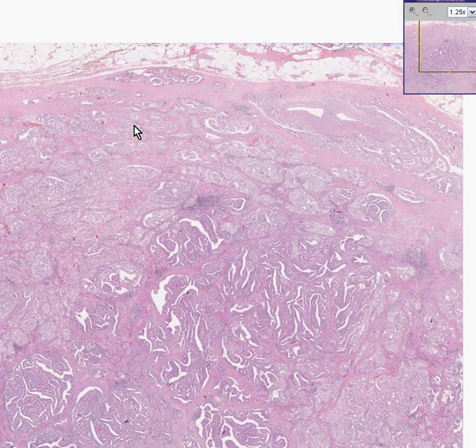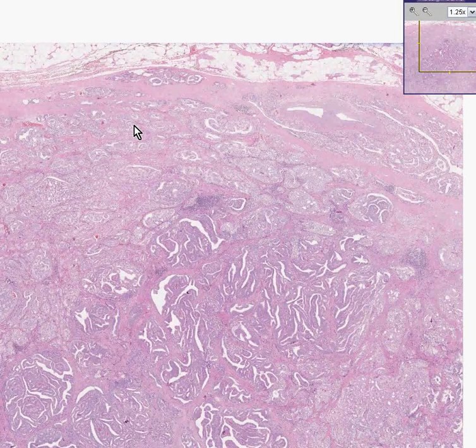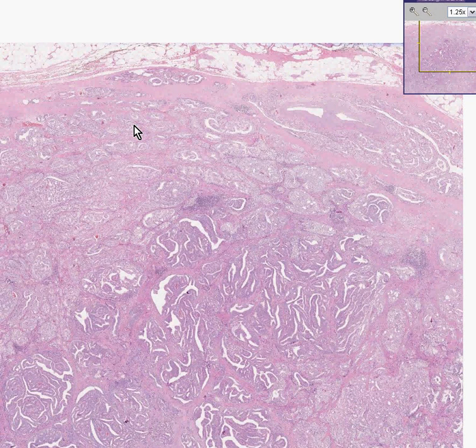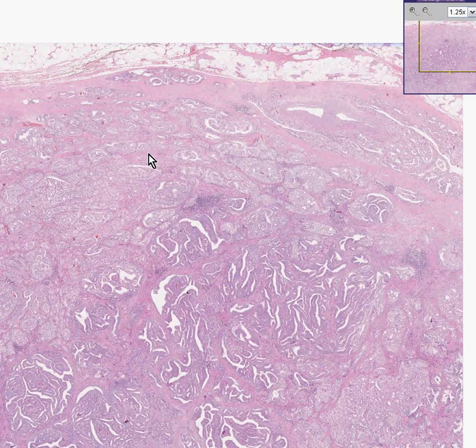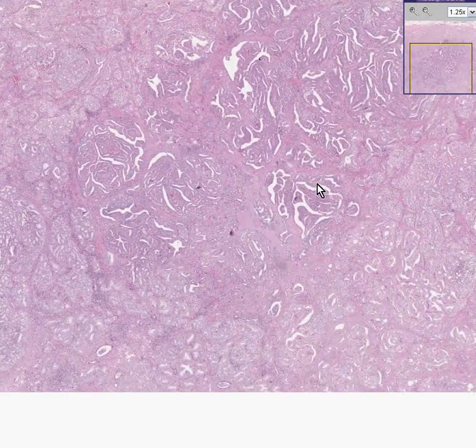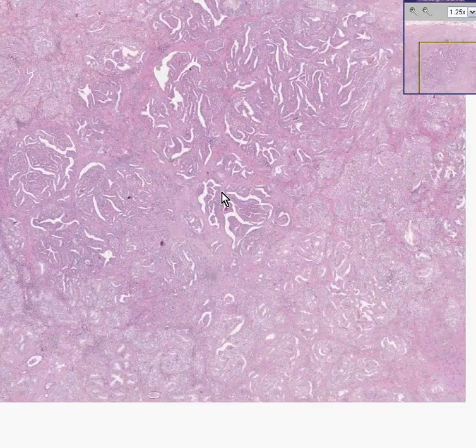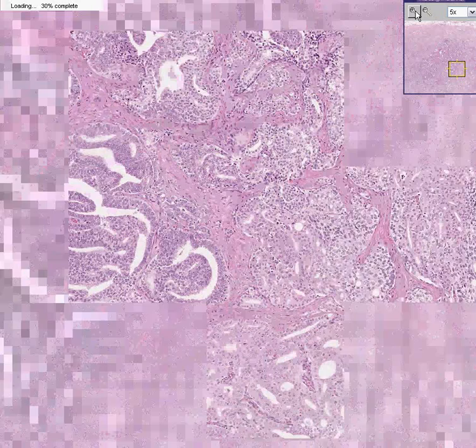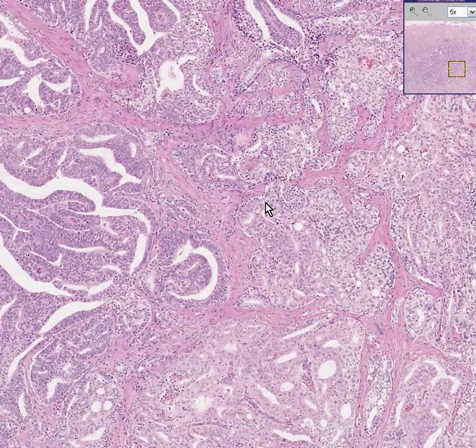If you remember what we just said, the lower the Gleason number, the more the adenocarcinoma cells resemble normal prostate. Then a high Gleason number would be an adenocarcinoma in which the cells do not look like normal prostate. The problem is in this particular piece of prostate tumor, there is no normal prostate. This is all cancer. So you're going to have to remember from the last couple of cases what a normal gland should look like.